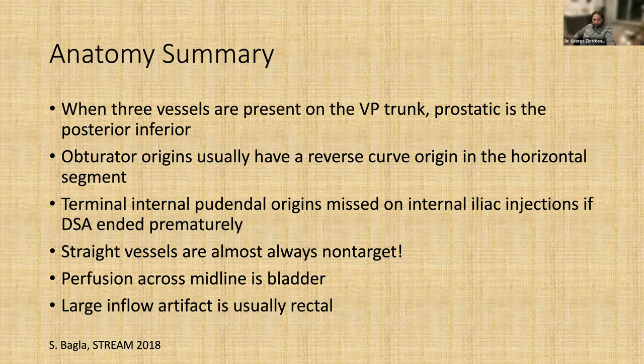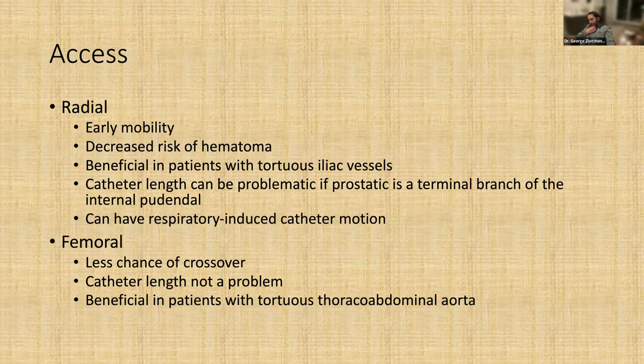Okay, so access. I try to start all patients radially. They have early mobility and decreased risk of hematoma. Patients love it. Only negative is you can't really do it in taller people, although our catheters are getting longer and longer. But your pushability may be limited.